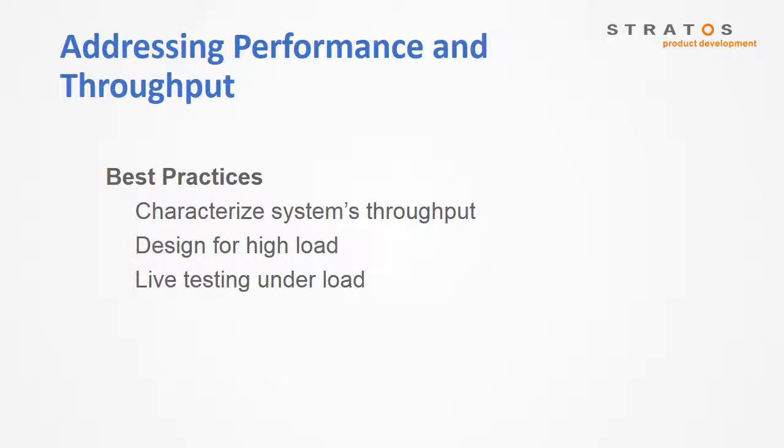Of course, it's possible for any system to eventually outgrow its design. That's why best practices mandate a design that includes automated system monitors and reporting, the creation of system load metrics, history, and statistics, so that the software can be updated to keep pace with growth. In other words, you need eyes and ears inside the cloud. You never want to be flying blind.